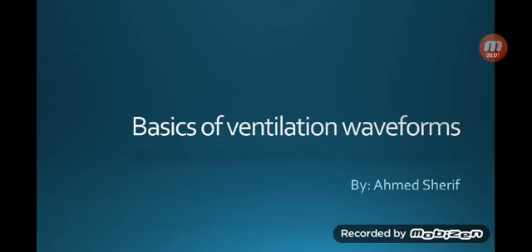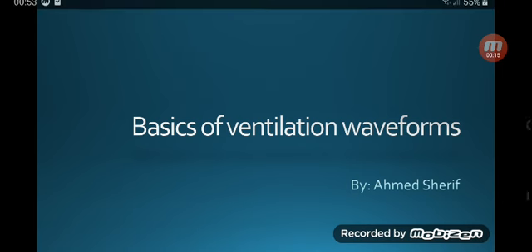Hello everyone, and welcome to a new online session where we're going to talk about the basics of ventilation waveforms, hopefully in less than 30 minutes. So basically we're trying to get the basics. We're not going to dive really deep.